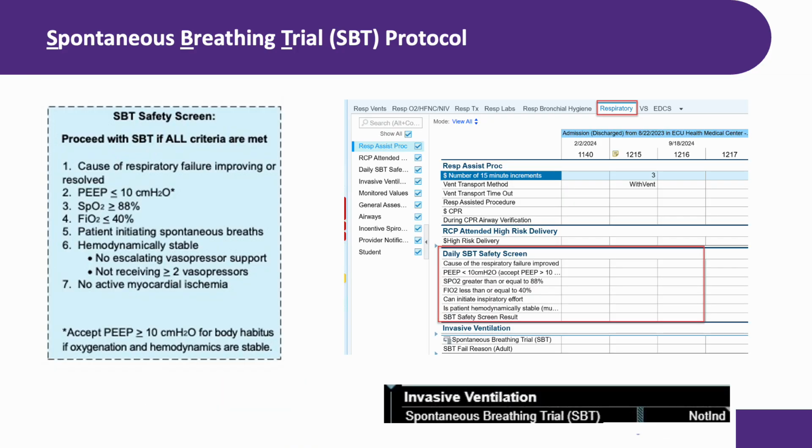Now, let's talk about what happens when a patient does not pass the SBT safety screen, because documentation of that outcome is just as important as documentation of a successful trial. So all patients are going to have a daily SBT safety screen above the invasive ventilation group.